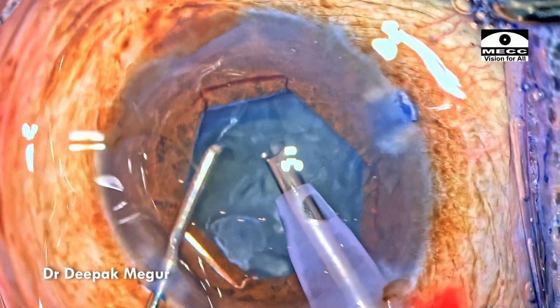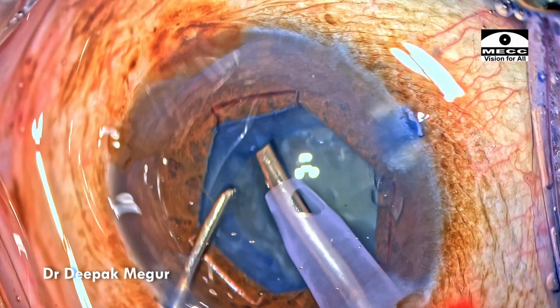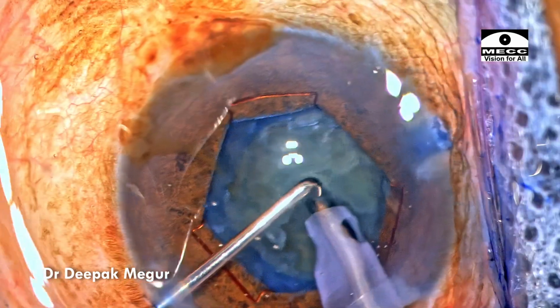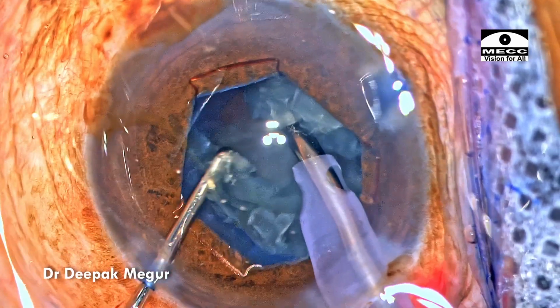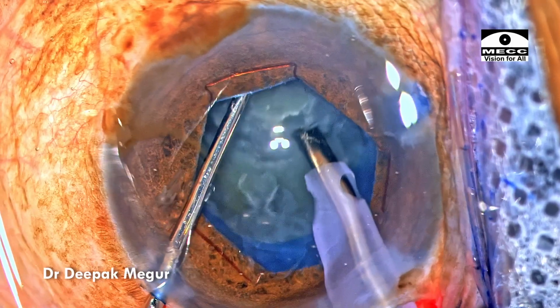The nucleus is relatively soft and easier to manage. The only thing is, during nucleus manipulation, we don't want to increase the zonular laxity. The bag is very floppy, and any maneuvering of the nucleus is going to bring the bag towards the phaco port. So this is something which I need to be mindful of.